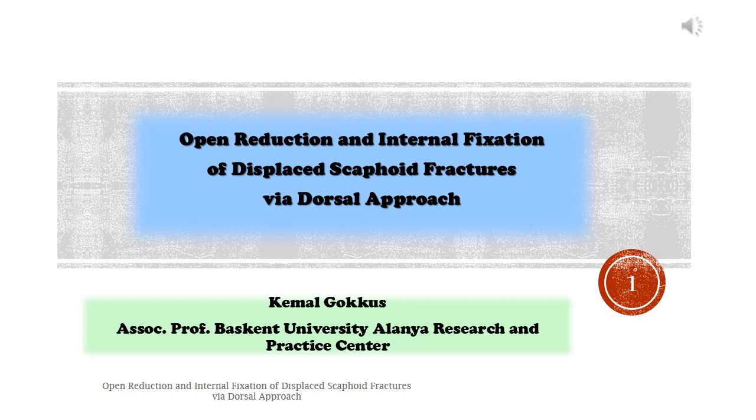Open reduction and internal fixation of displaced scaphoid fractures via dorsal approach.